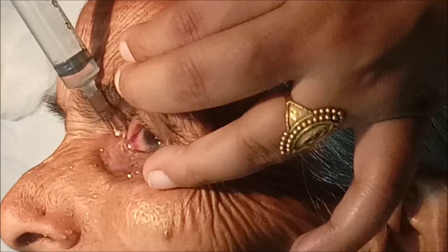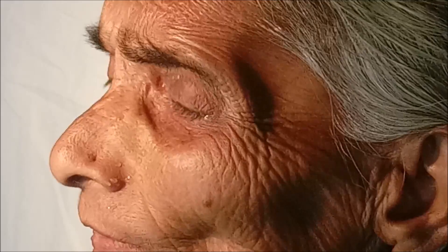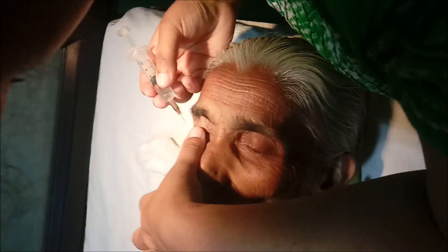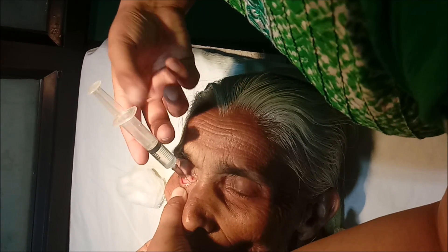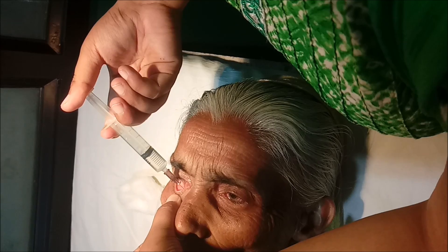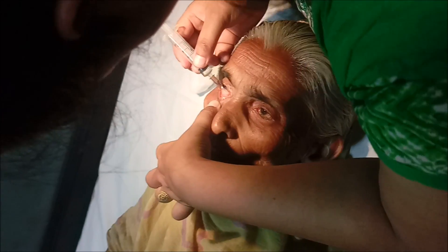We take a syringe, fill it with normal saline, and pass the irrigation cannula into the punctum. We then advance it through the canaliculus to reach the lacrimal fossa. The normal saline is then pushed through.